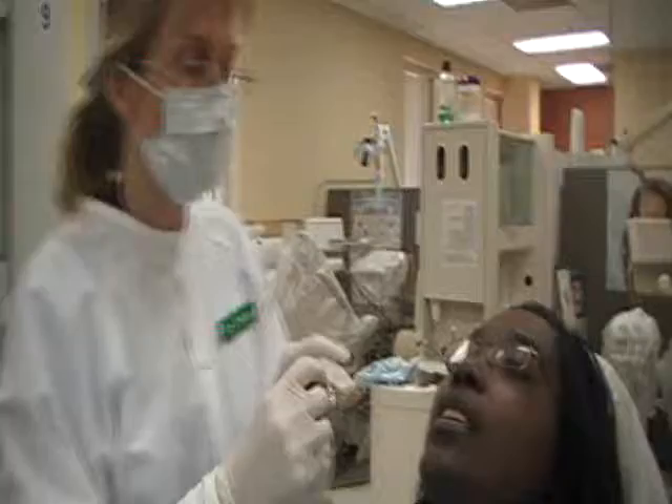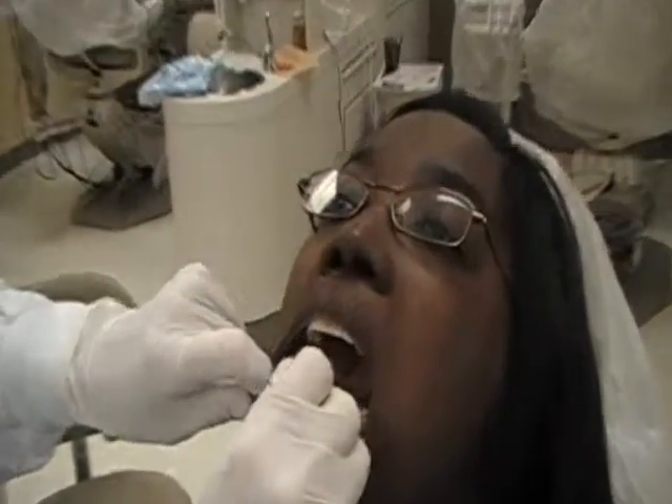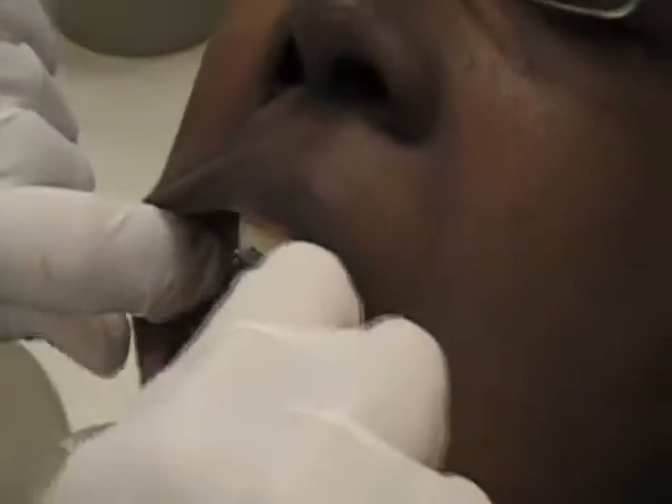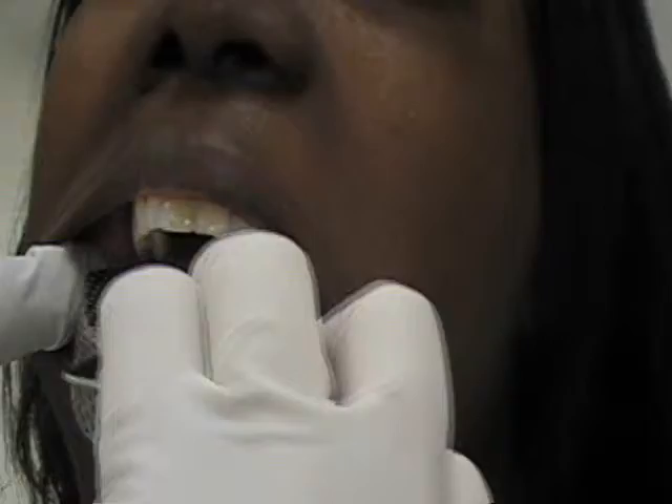And then for the lower, notice how I'm putting the tray in at an angle and then placing. If you will lift your tongue up and out at me — and what I'm looking for here is to see that the retromolar areas are covered, and they are. So we know we have the correct tray size.